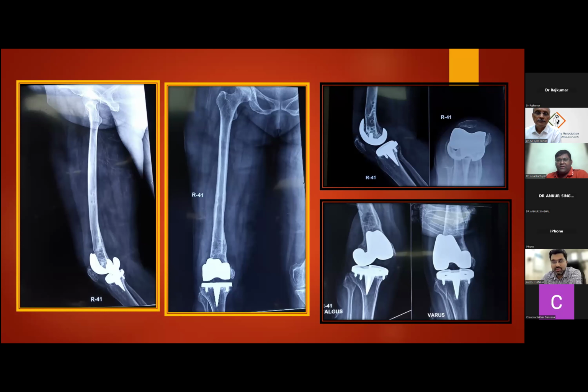Yeah, to start with, I think the knee was not balanced. If you see the normal weight-bearing X-ray again, there are unequal gaps, with more opening on the medial side. So the MCL got stretched out over a period of time because she's obese and overweight. Over a period of time, the MCL has undergone attritional rupture, I think, because of the imbalance at the index surgery. That makes more sense.